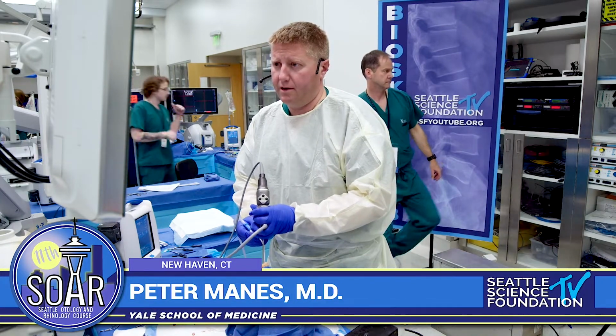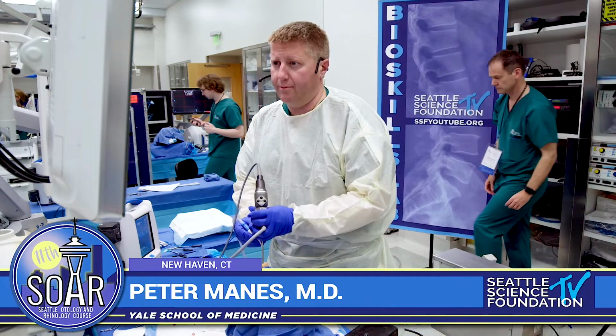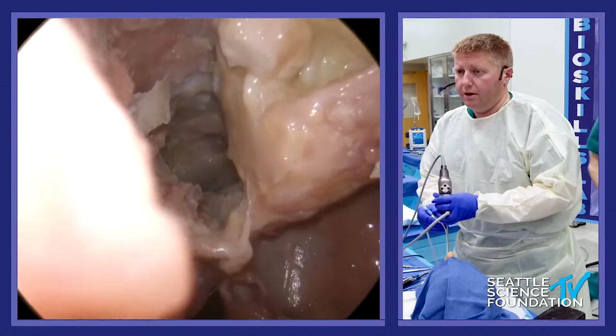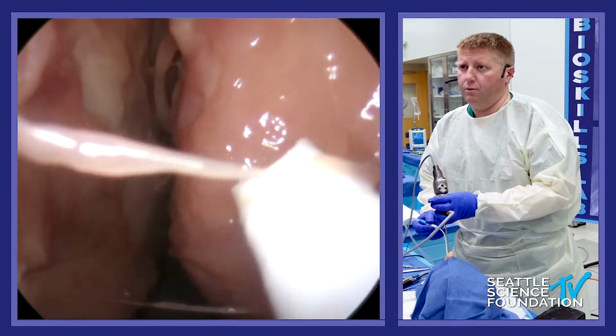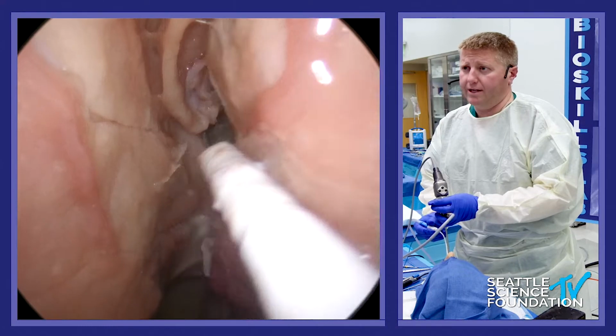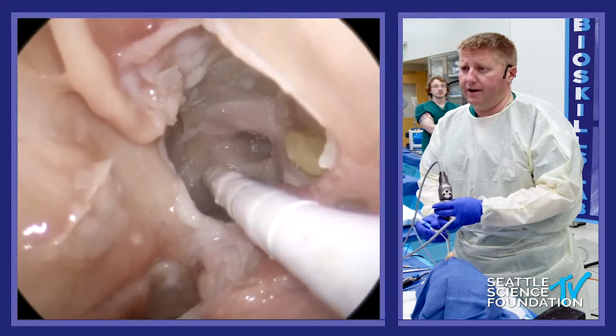As we talked earlier, there's a couple different ways to get to the sphenoid. Obviously, in this cadaver, we've gone through the ethmoid sinuses, we've gone transethmoid, and we can get into the sphenoid here. Typically, if you're doing a pituitary, those ethmoids won't be open, and while you can do it, it's also pretty easy to go transnasal.